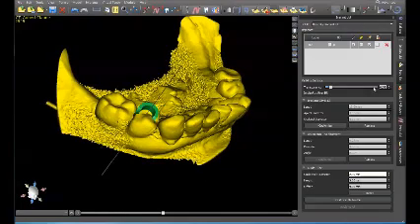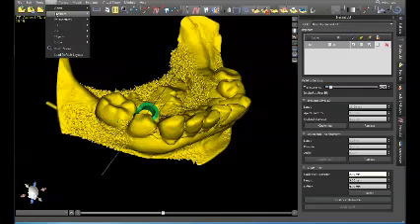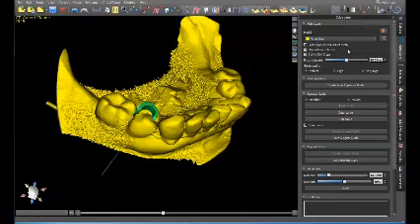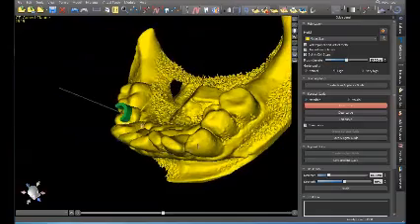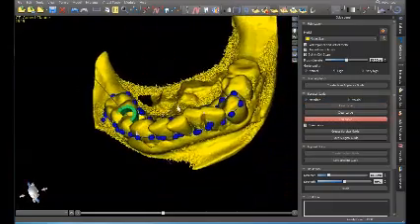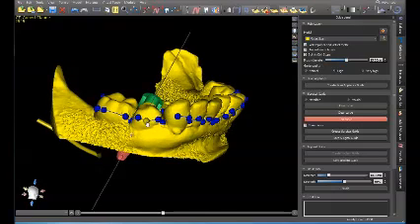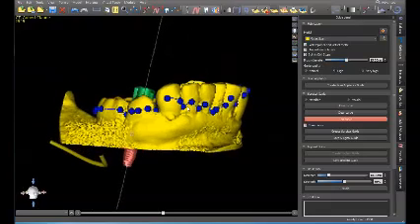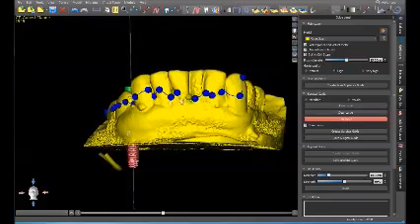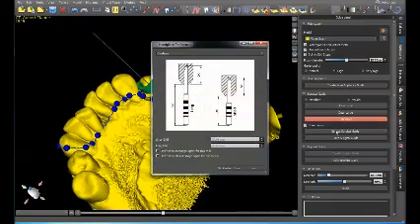At this point, we'll go into add panel view. We'll add in not model manipulation, but guide panel. There we go. And then make sure you click on model. Quality of the guide, we're going to click on high. Mandible, draw curve. I always like to cross the arch. Edit curve. That looks pretty good. So create surgical guide.